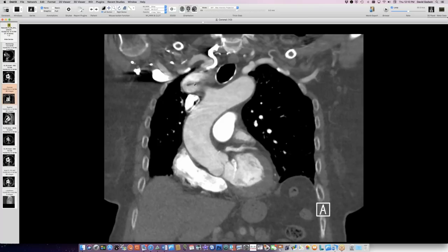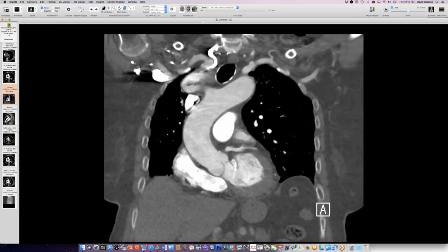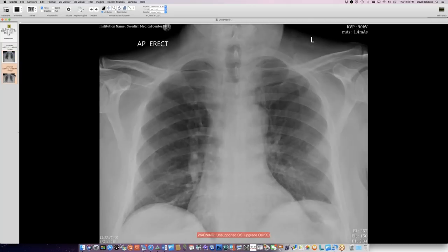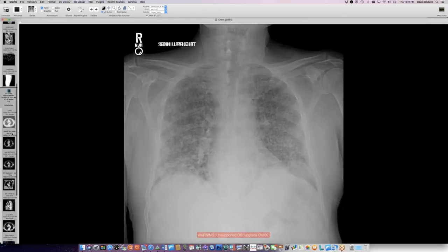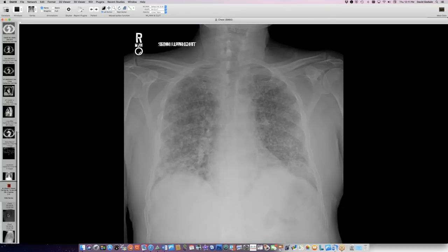Very nice. This is one of the cases I sent to Arun, so you may have seen it in the last couple of weeks. Then this man has myelofibrosis — you can see there's some sclerosis of his bones. He has reduced immune capacity. Let me show you another exam on him. He developed this diffuse fine nodular lung disease. Let me show you the earlier images: he went from having a radiograph with clear lungs but low lung volume to having all of these nodules throughout, with some larger nodules in the right base.